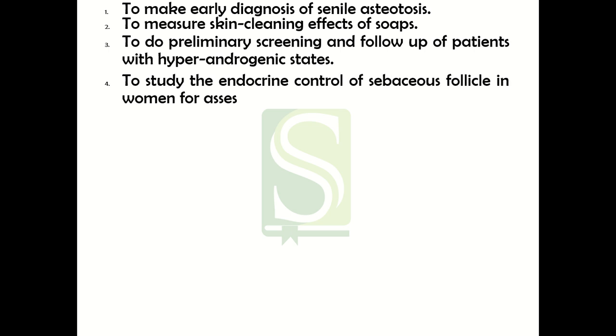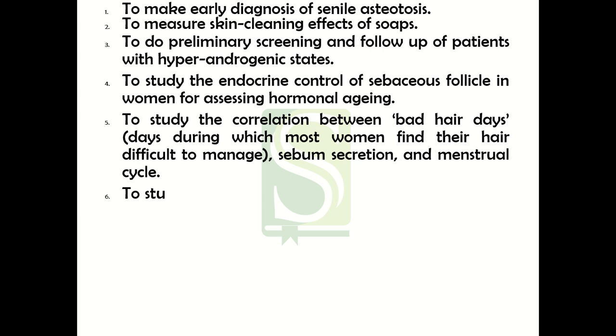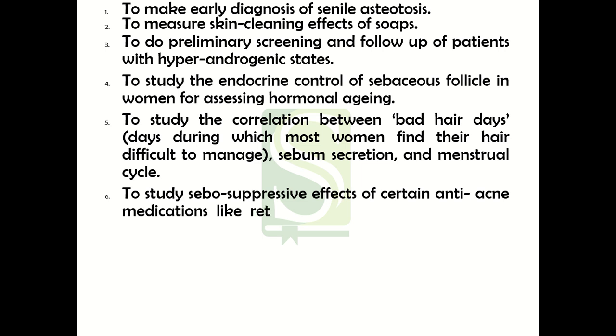It helps you to measure the cleaning effects of soaps, to do preliminary screening and follow-up of patients with hyperandrogenic states, to study the endocrine control of sebaceous follicle in women for assessing hormonal aging, to study the correlation between bad hair days, during which most women find their hair difficult to manage, and the sebum secretion at that time, and it is also related with your menstrual cycle.